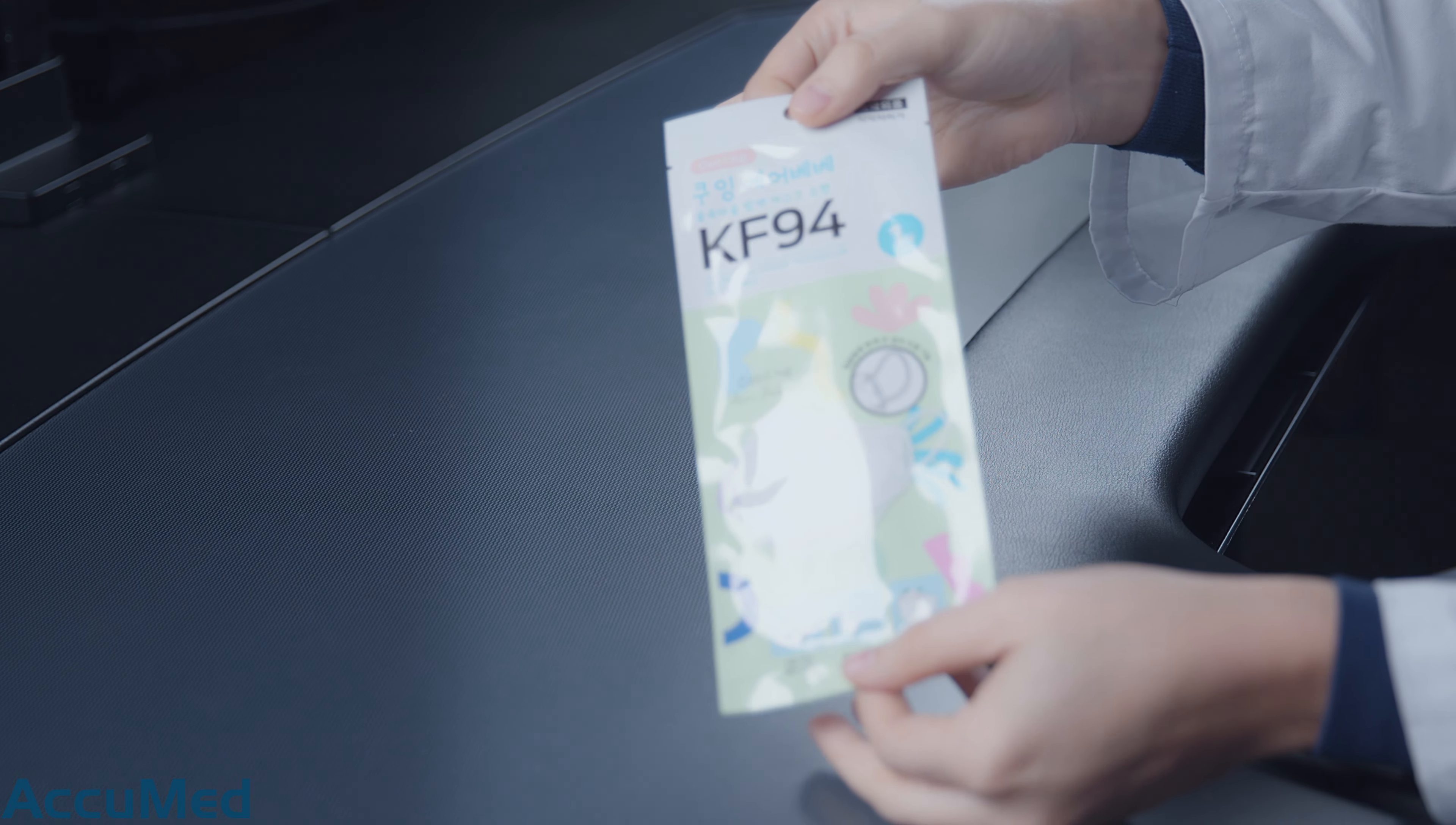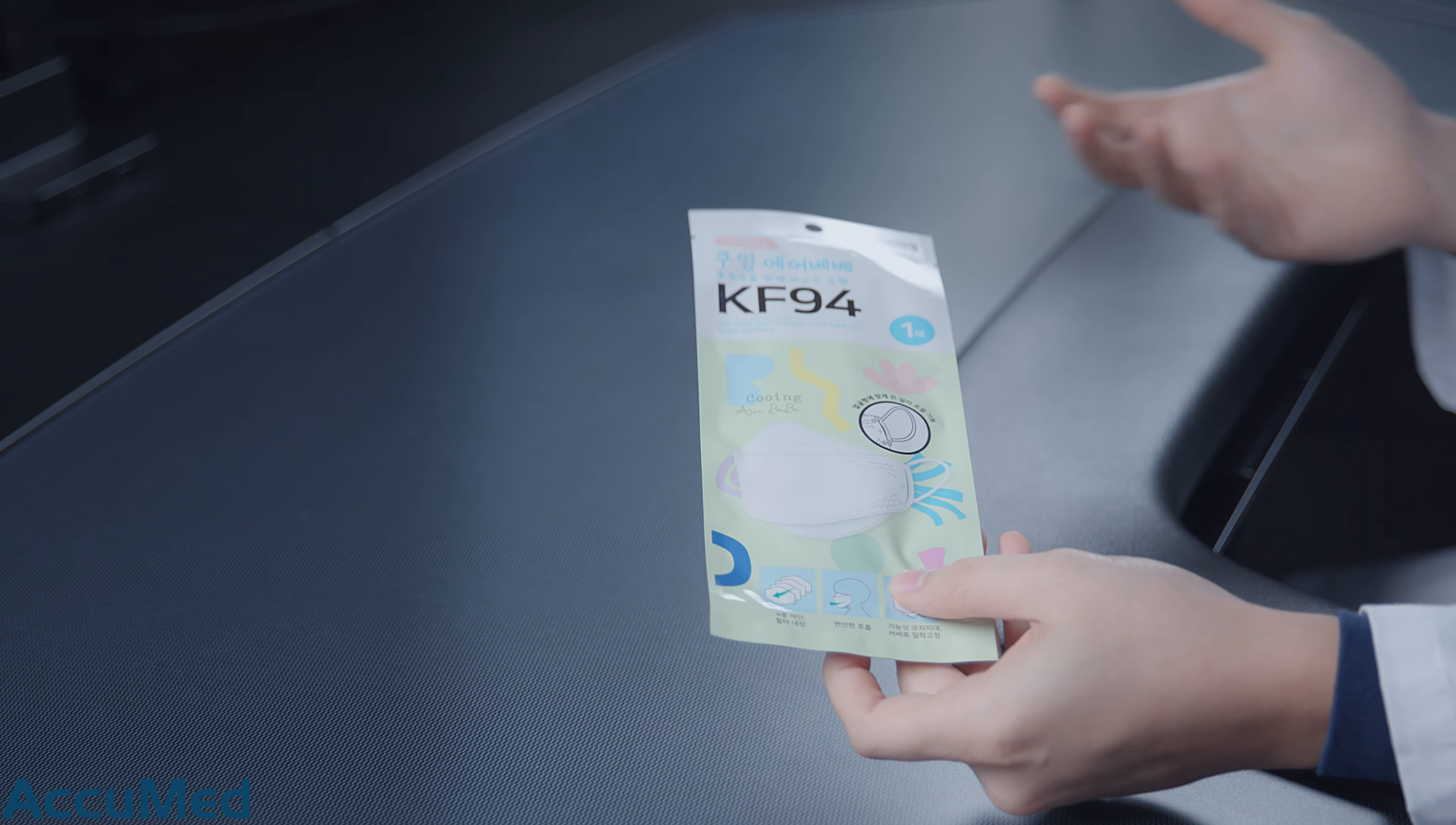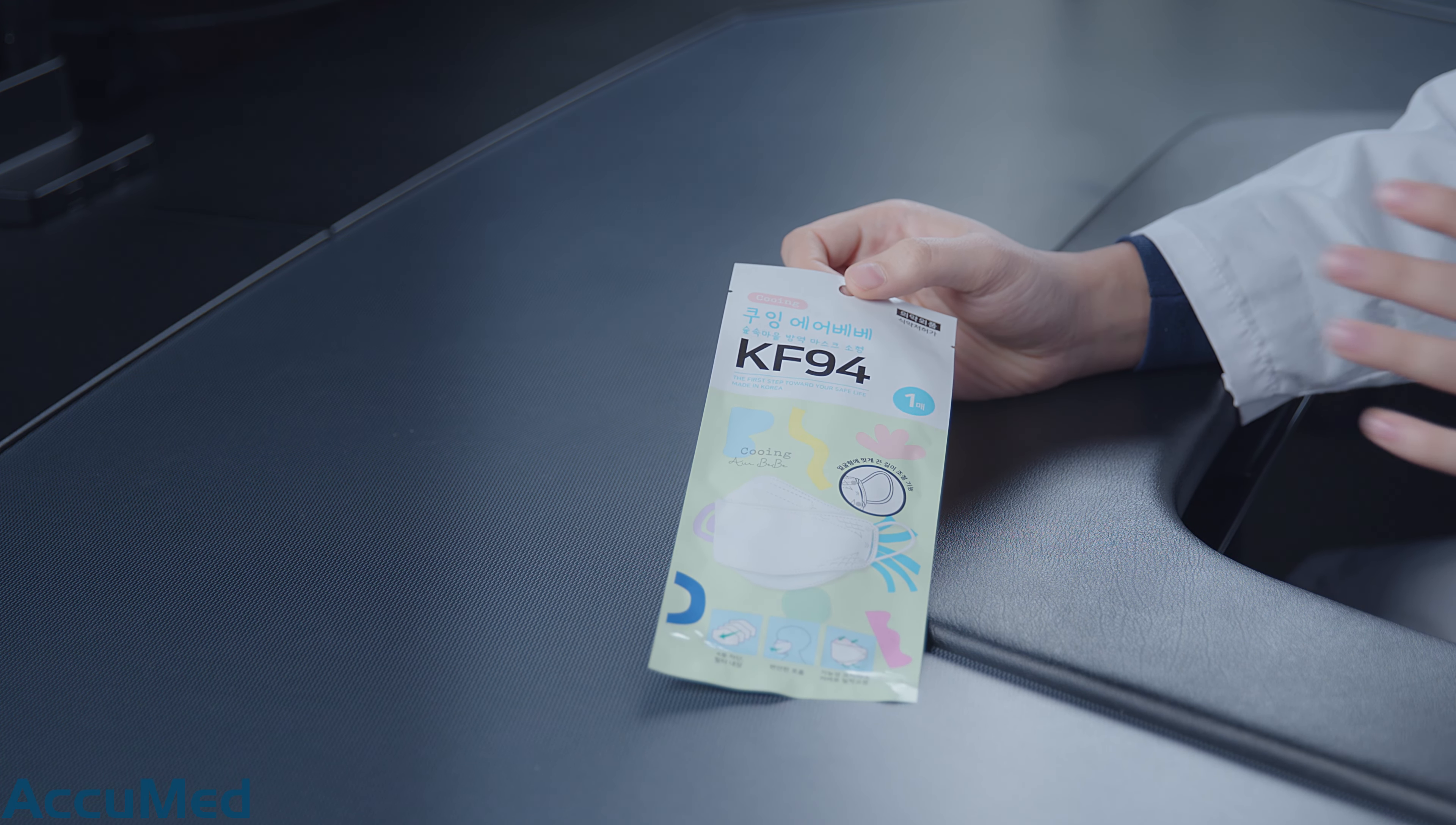Here's how the packaging looks. I do like the KF94s because of their packaging. They're all individually wrapped and they're wrapped really nice. I don't know what that says environmentally speaking, I don't know if they use reusable plastic, but that's not what we're testing. We're testing the filtration efficiency and the pressure drop. That's the most important thing.